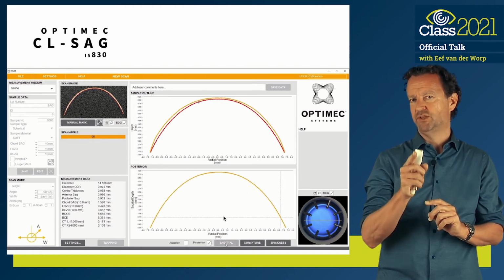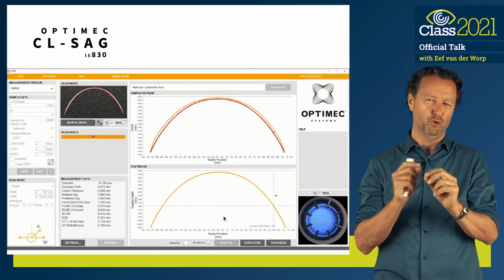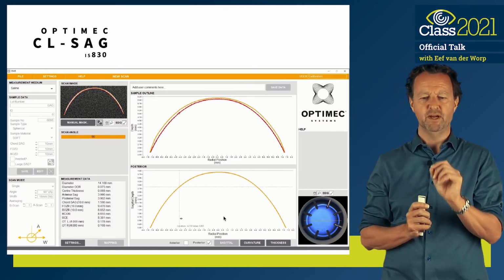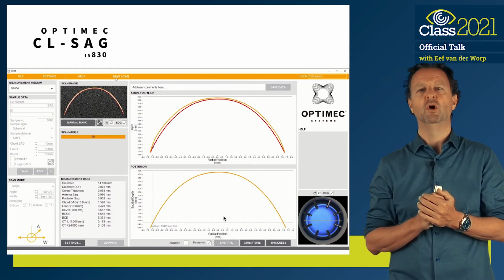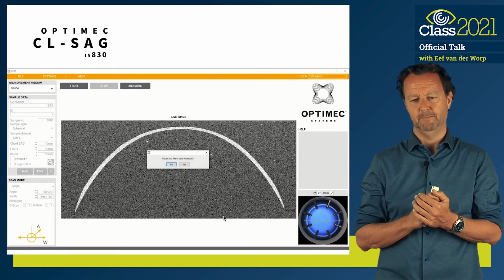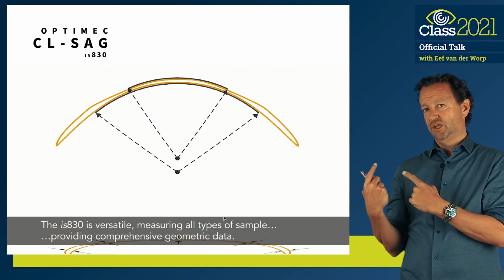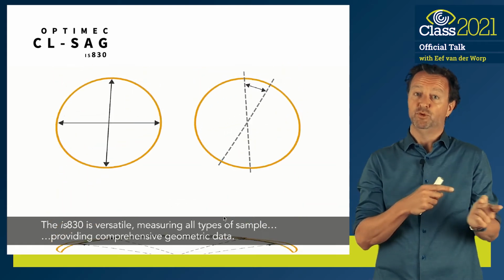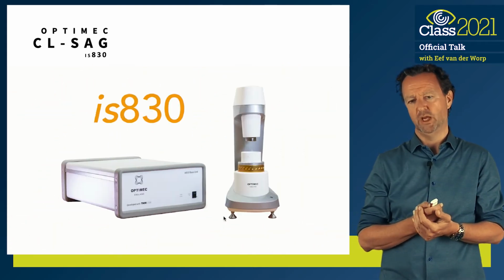standard. But I'll get back to you on that temperature thing in just a little bit, because there's a little bit more to it actually. We measured all these lenses, the same with the other instrument that I showed you, all at 20C. So we know a thing or two that we didn't know up to very recently, and we're actually updating that as we go along.